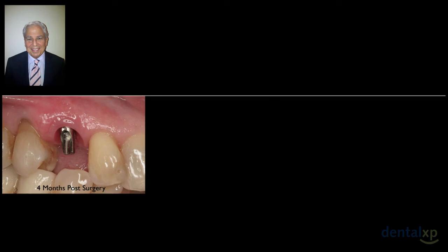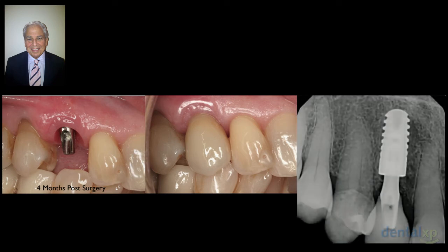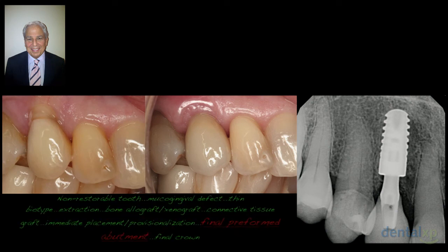Bill has done everything. So you can see the advantage of placing that abutment on at the time and having a convergent abutment so that we're getting a thicker amount of soft tissue. So finally, I come into the act, I do a snap impression, with a pickup impression, the laboratory makes a crown for me, and you can see the beautiful result that we have. But we take a look at what was going on from the beginning of this particular case to the final result of this case, but here's a whole key.